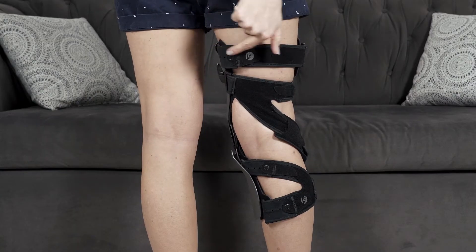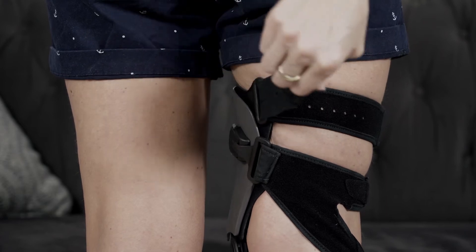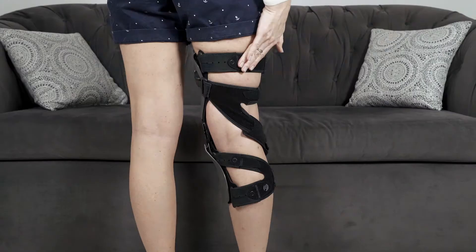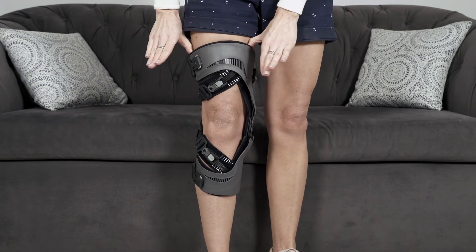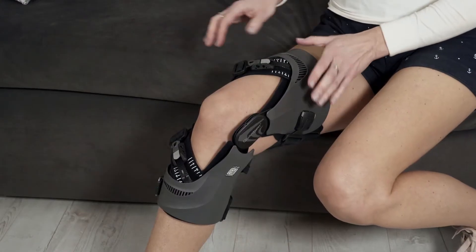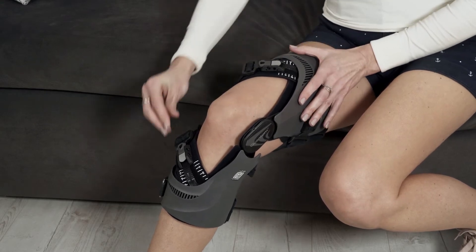If the brace is not tight enough on the thigh, increase the proximal thigh strap tension. If additional adjustments are still needed, you can increase the tension using the proximal ratchet system.